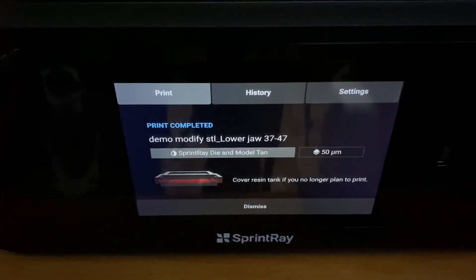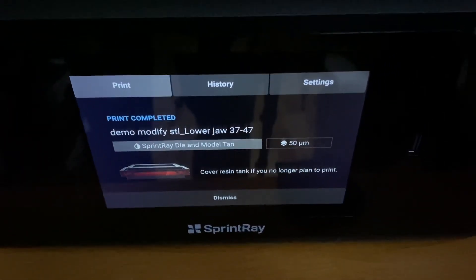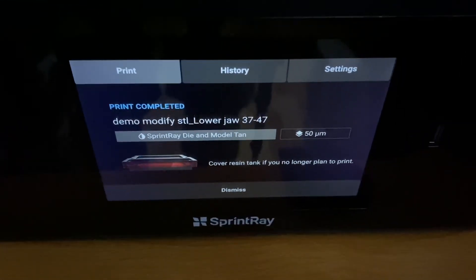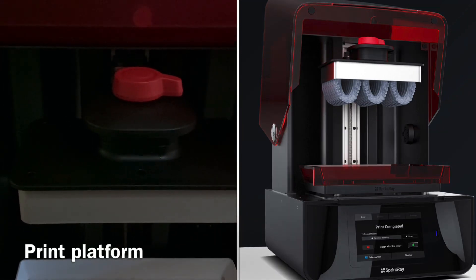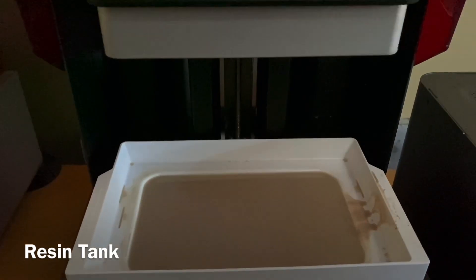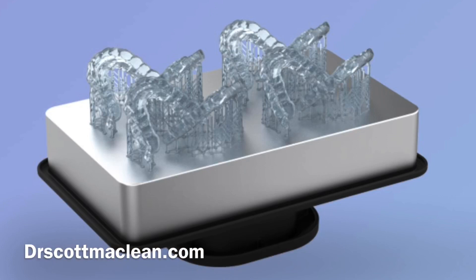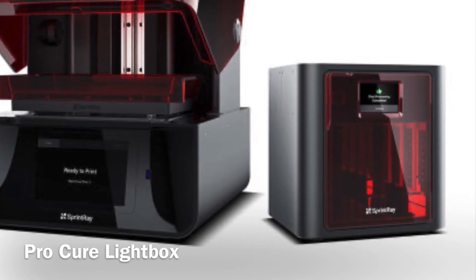On the LED screen you can see we have the resolution set to 50 microns, which produces a very smooth model for doing accurate dentistry. The project all starts on the print platform, which you can see is attached with that orange knob - you'll be able to take this off. Many projects can be done at the same time; they drop down into the resin tank and the light starts to turn on and create the project. You can also see a USB port if you want to put the project directly into the printer.